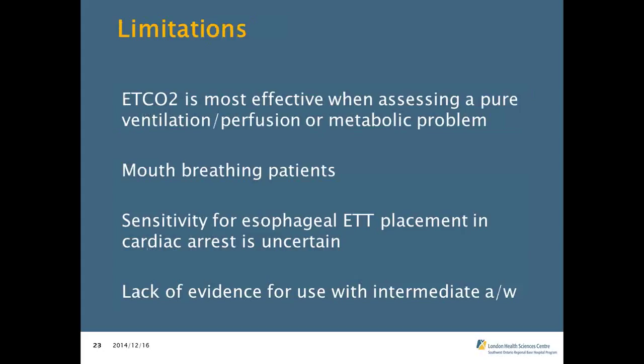So we should quickly just review some of the limitations we did talk about throughout the webinar that Matt had mentioned. EndTidal CO2 monitoring is most effective when assessing a pure ventilation or perfusion or metabolic problem. So for example, it's not going to be of great value even if you assess the trends in a patient suffering what we assume is acute pulmonary edema. However, this is from an acute myocardial infarction, which has caused a decrease in cardiac output as well. So that's not going to be effective.